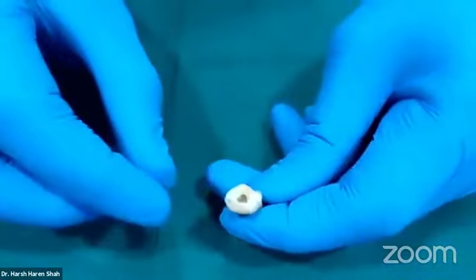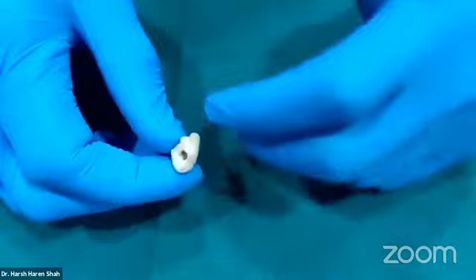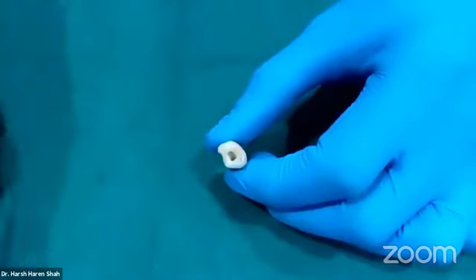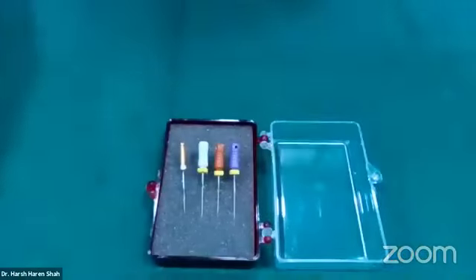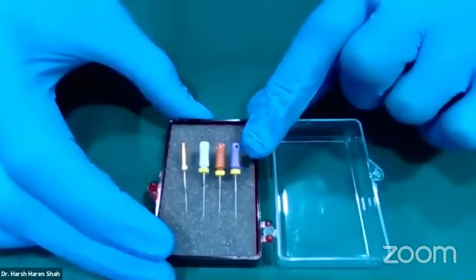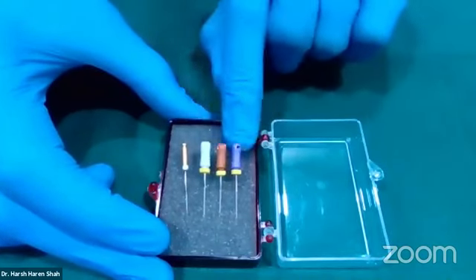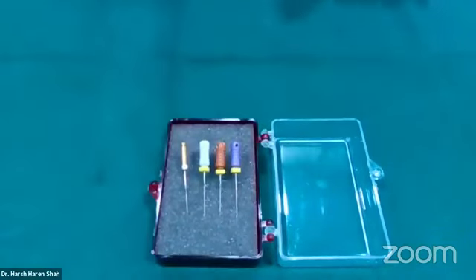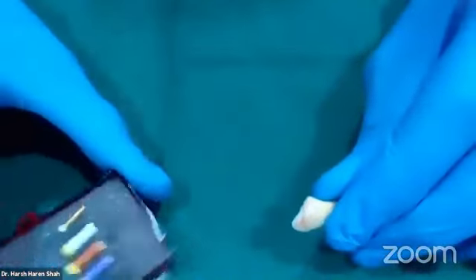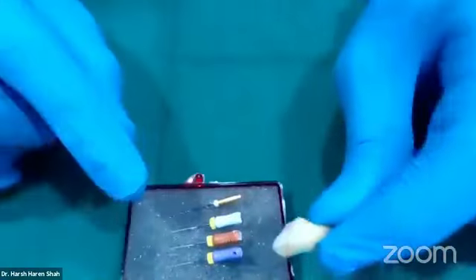So the orifice widening and the access preparation are done. We have carried out irrigation just once so far. And I am sitting here with my set of instruments. What I have here is a 10 number file, a 12 number file, and a 15 number file. These are all K files that we are talking about right now. And then we have a rotary file. The first method of glide path preparation that I will show you is the first one that we took in the presentation, that is manual preparation of the glide path.